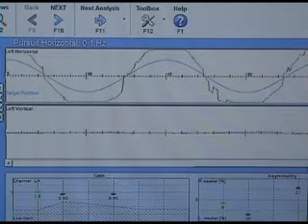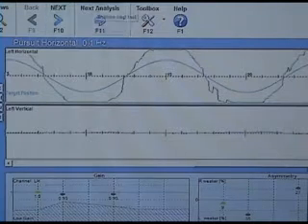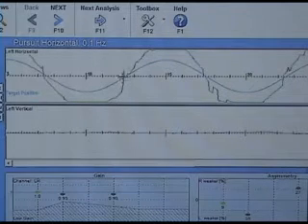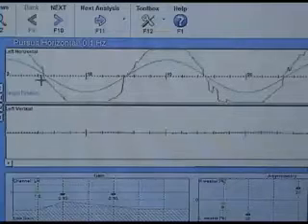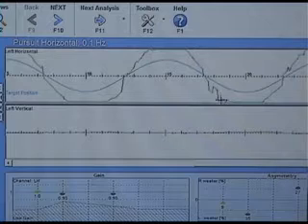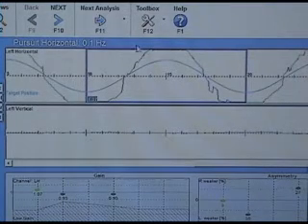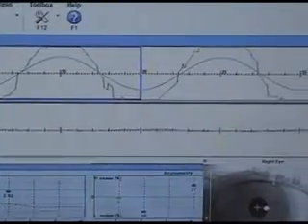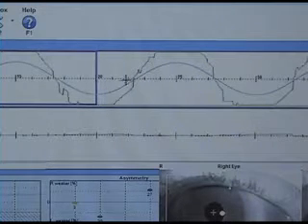Here is a patient, again, doing horizontal pursuits at 0.1 hertz, and if you can see, this is where they should be. So this particular individual is unable to even stay on the target. He's either ahead or behind the target, and it requires him to make these jerky eye movements to get back to the target. So as you can see, that's not what we like to see. This patient again has a balance disorder and chronic pain, and if you look in here, bounciness, jerkiness, jerkiness.